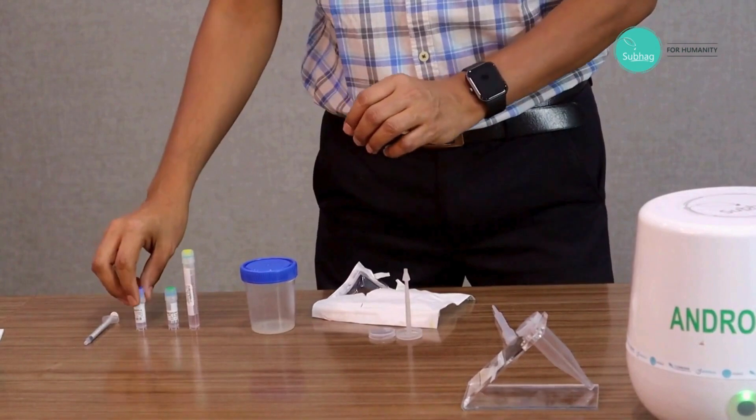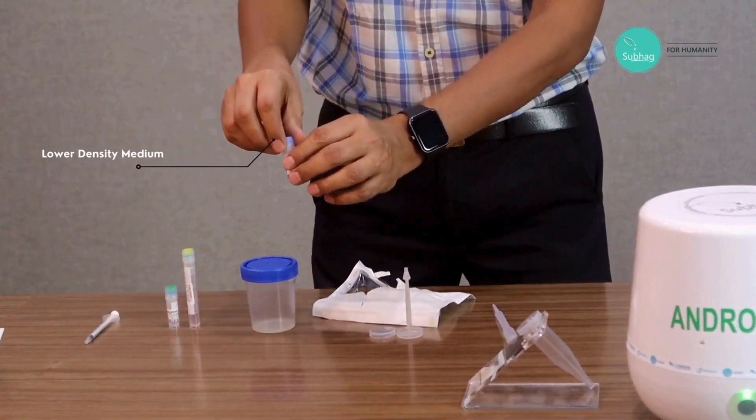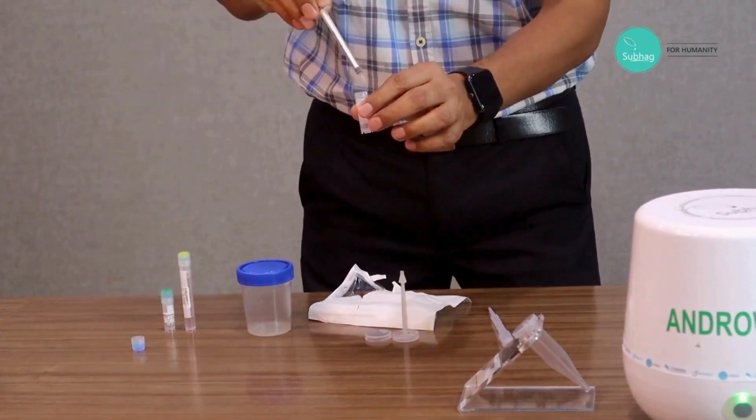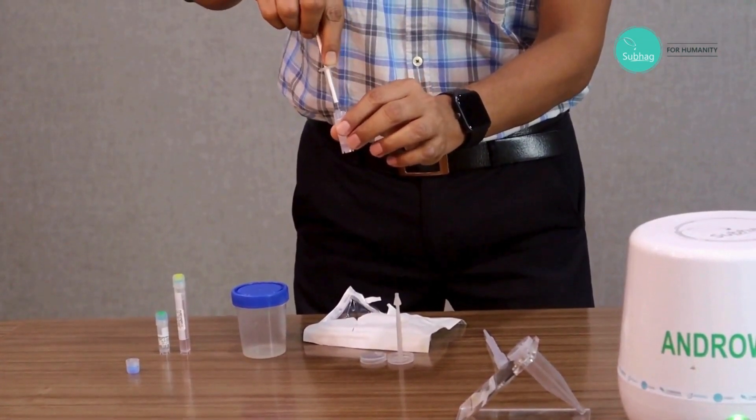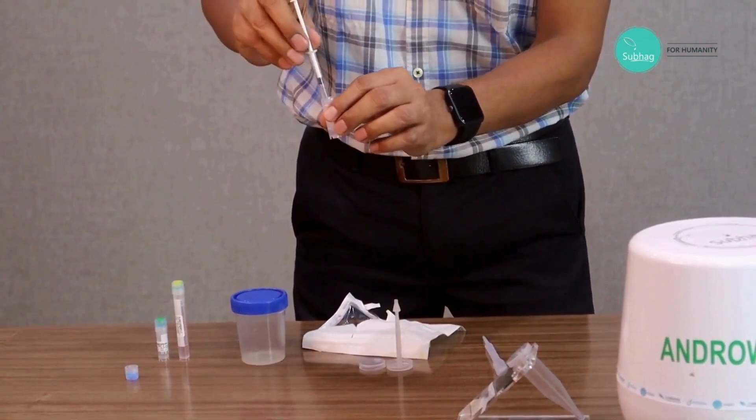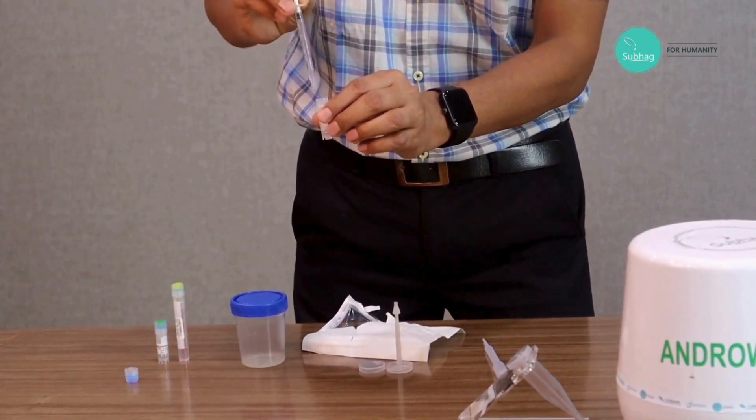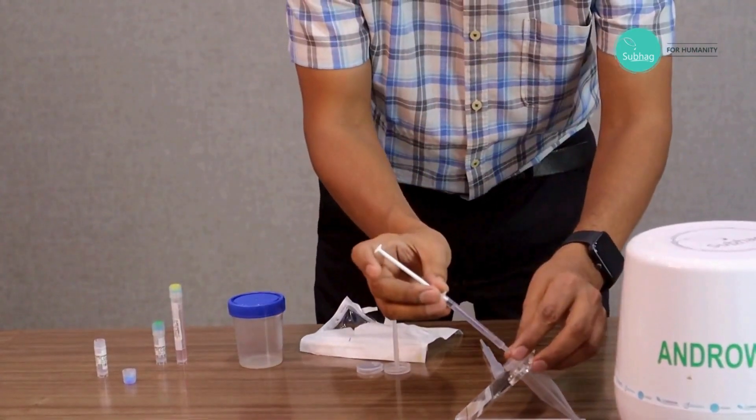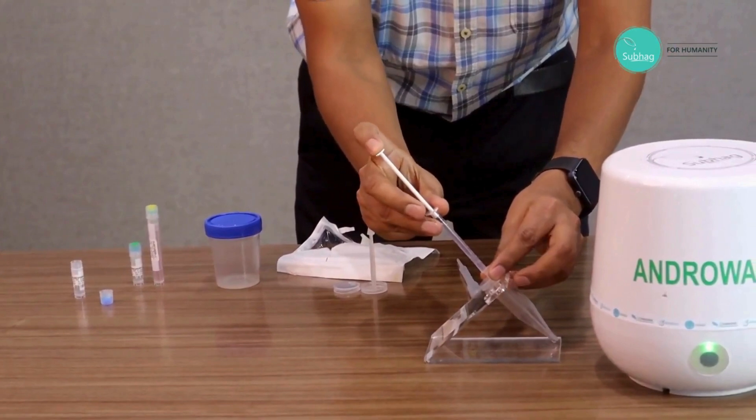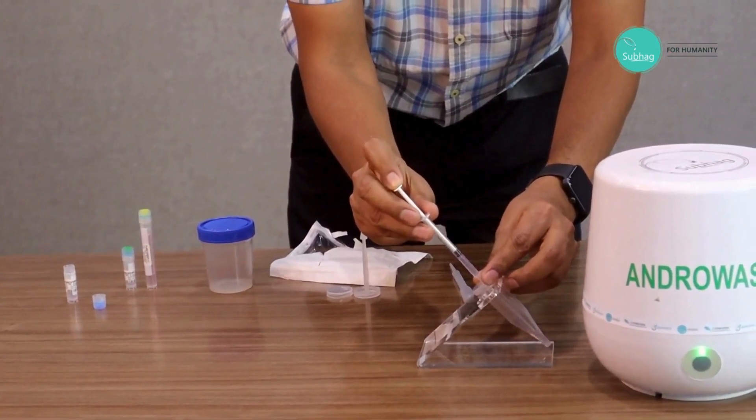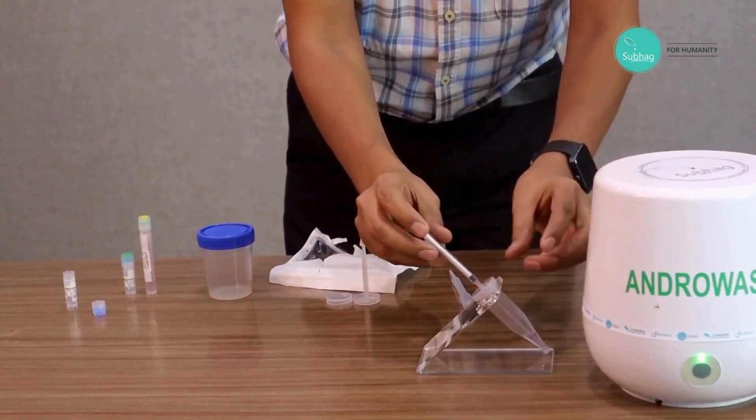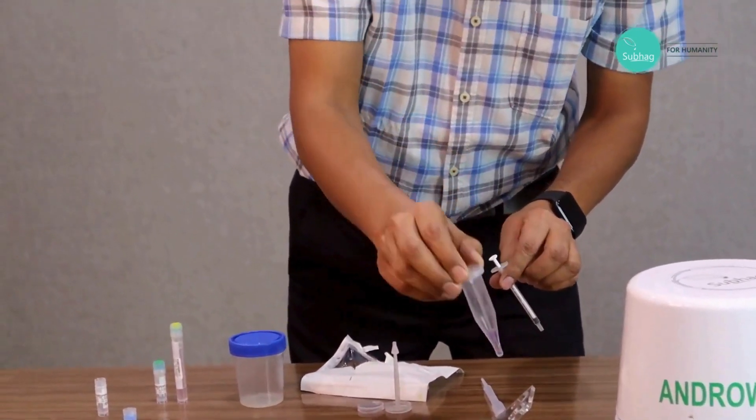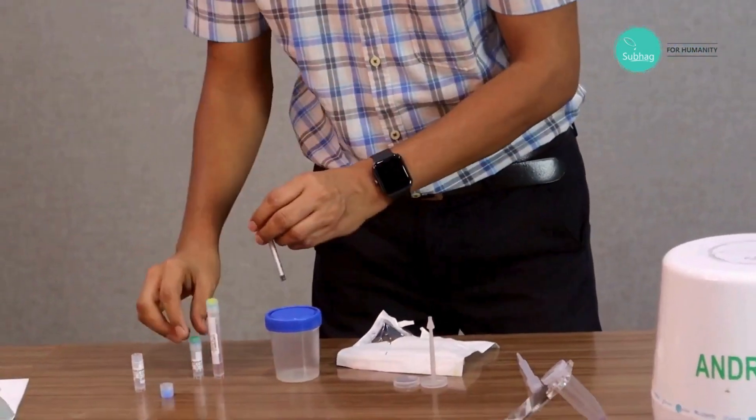Then we take the density gradient, low density gradient first. We take the entire volume at a time with the help of this syringe, take it fully, and then attach it to cap one and then inject it fully. So the low density layer is done.